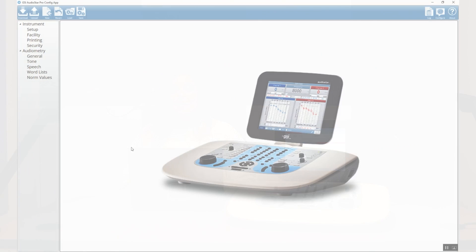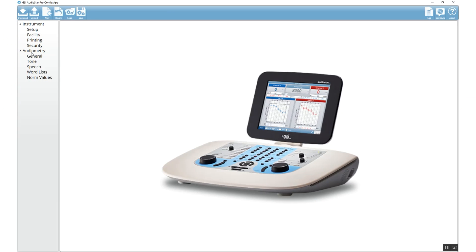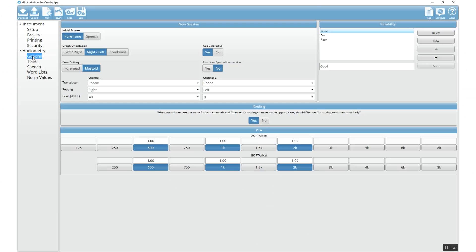We're going to open up the configuration application. Please remember when you open the configuration application and you're going to make changes to your AudioStar Pro, the first thing you do is press Upload. That will bring all of the settings from the instrument into the config app. You can then make your changes and download them back into the AudioStar Pro. To access the weighted pure tone average, go into the Audiometry section and then into the General section.